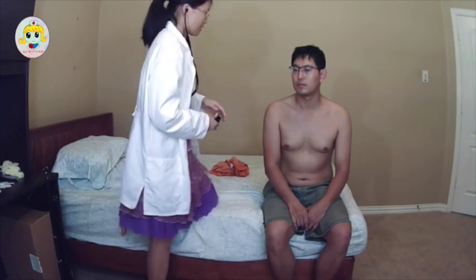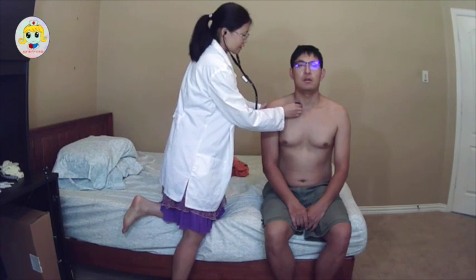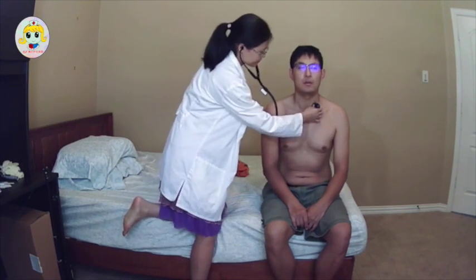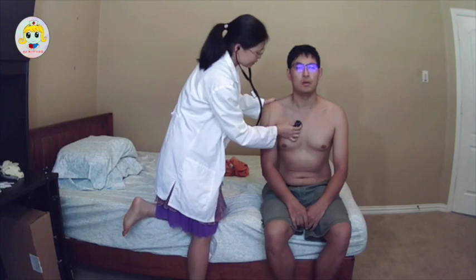Next, I will listen to the lung sounds. I will use the diaphragm of my stethoscope. You can deep breathe through your mouth for me, okay? The trachea area. The second intercostal space.